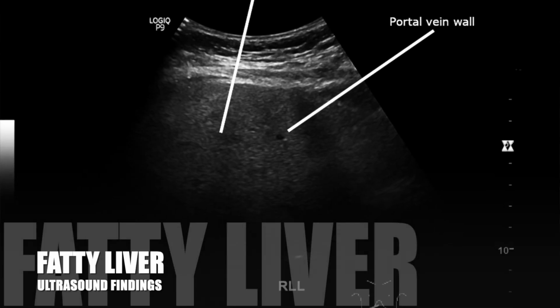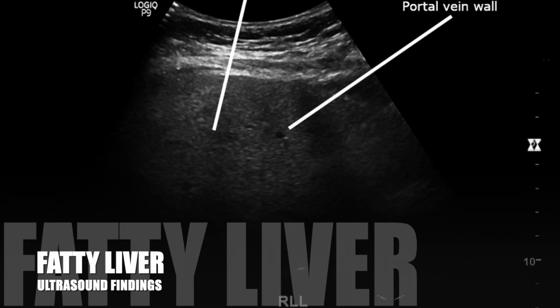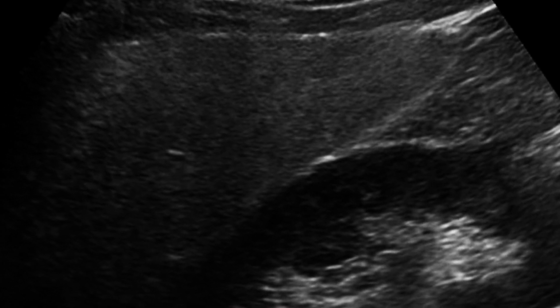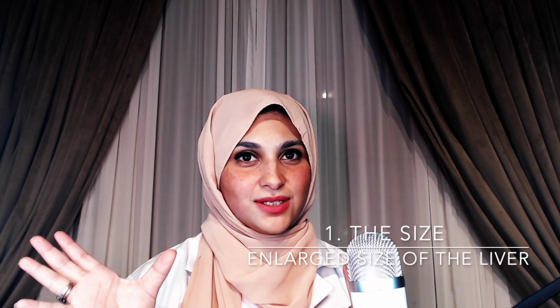Now let's talk about the fatty infiltration of the liver. When can I call a liver fatty liver? It's when fat accumulation exceeds 5% of the liver weight. Ultrasound findings of fatty liver. Now let's compare the same points that I spoke about, a normal liver from a fatty liver. The size of a fatty liver is usually enlarged, so enlarged size of liver.